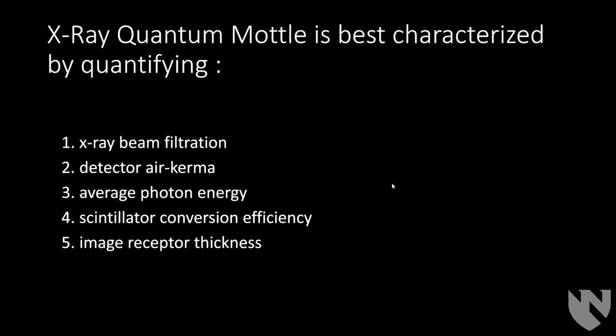So how do you quantify quantum noise the best way? Well, I'll let you pause and think about it, and then I'll tell you. The best way would be the detector exposure curve. So the number of X-rays reaching the detector would best predict your quantum noise.